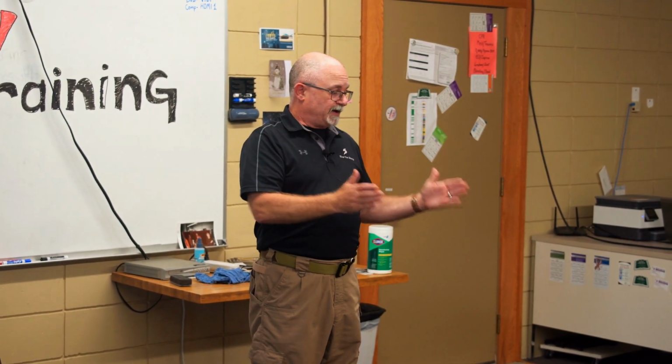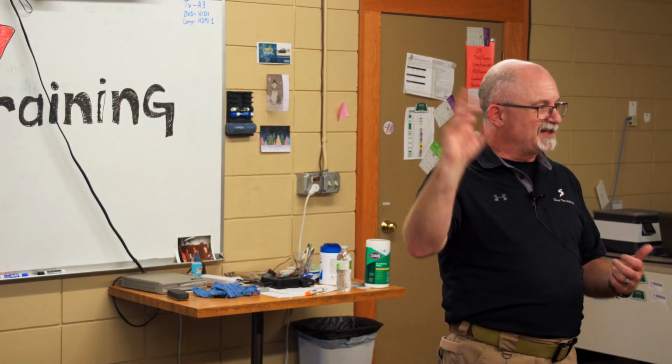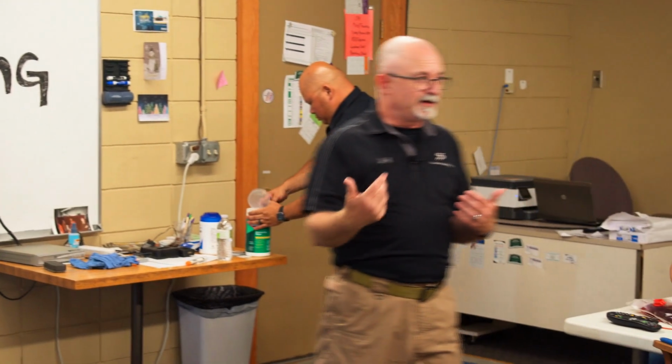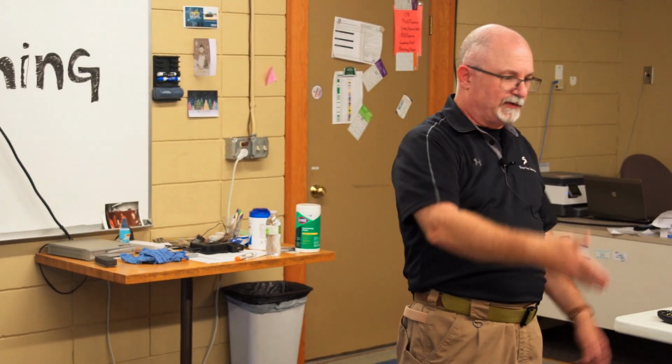But there was a long-held belief in our guidelines that EMTs couldn't do IOs unless they had a GCS of 3. Well, turns out that was never in our guidelines. It was one of these things that had been handed down and handed down. We looked at our guidelines and talked to our doc and he says, no, if they're semi-conscious, the lidocaine usually can kind of help with that IO piece, but there's no reason you can't. So if they're in extremis and you really need to do that, and if they're that gorked out anyway with a glucose of 21, they're not going to feel it anyway.